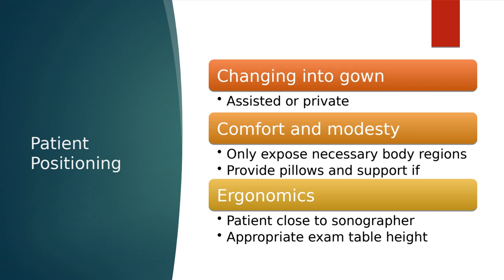And then you're asking if they would like a private room, maybe saying if there's a changing room that they can use, or using the exam room to change into their gown. We also want to make sure that the patient is comfortable and modest at all times. So whether we're changing our patient or not, you want to make sure that you are only exposing the body regions necessary for that exam. So this becomes very particular when we're starting to scan breast and we're scanning scrotal. So we'll definitely be coming back to modesty a lot, especially in that spring semester.